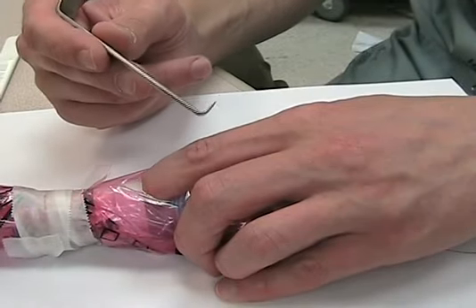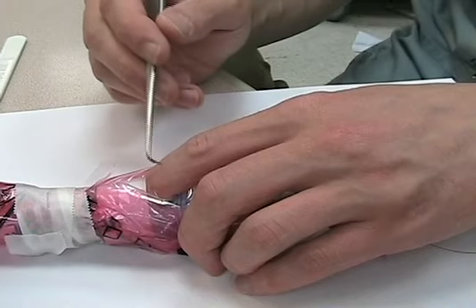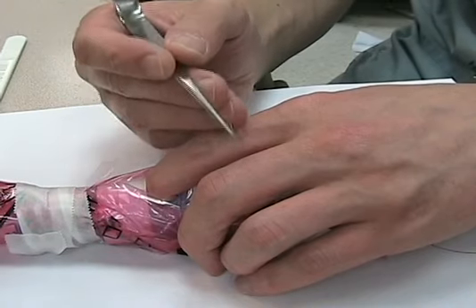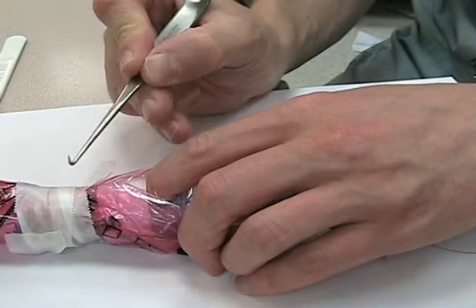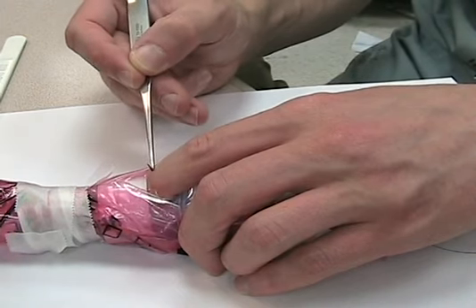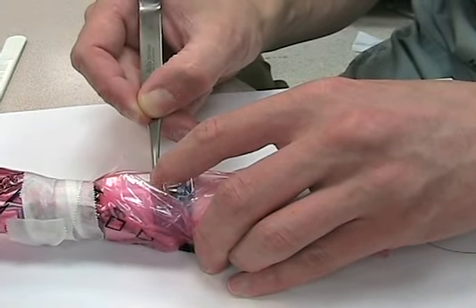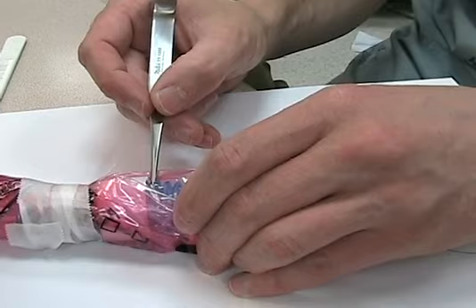Grab your tracheal hook. It goes in not with the spike end down — you'll cut your finger — it goes in with the spike end facing the ceiling. That puts the nice soft rounded tip up against your index finger, and you're going to slide that into the hole. Now you can take your index finger out because the hook is in there.